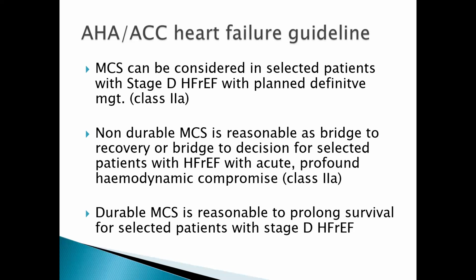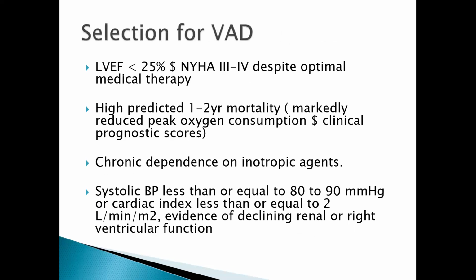Then the next slide, please. Also, under the American Heart Association, selection for ventricular assist device. Other patients who can qualify for a ventricular assist device include patients who have a left ventricular ejection fraction of less than 25%, and also a New York Heart Association class 3 or 4 who have been on optimal medical therapy, but the patient is not doing well. You actually consider this patient for a ventricular assist device.